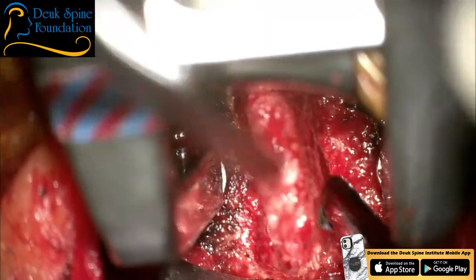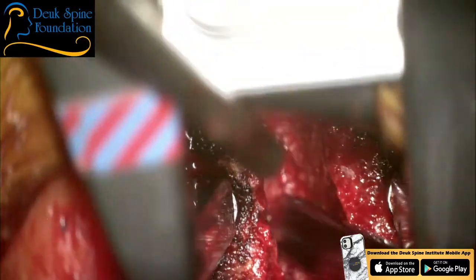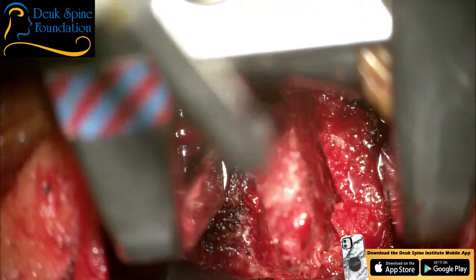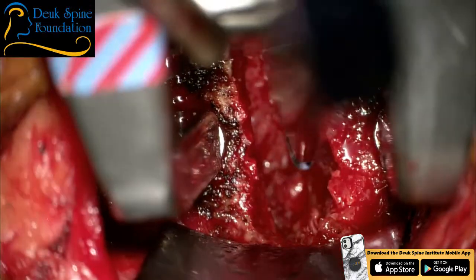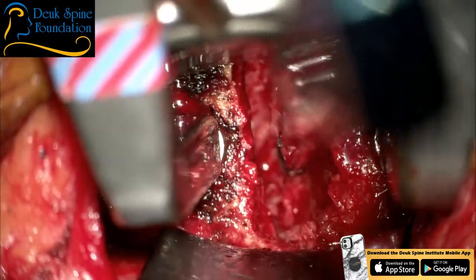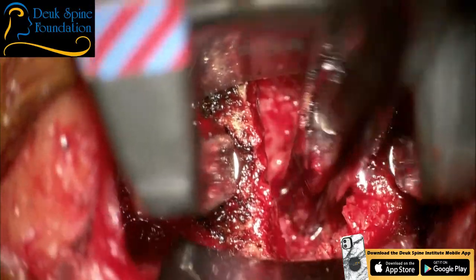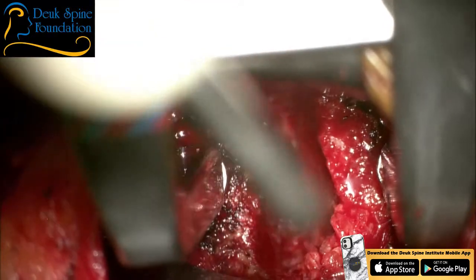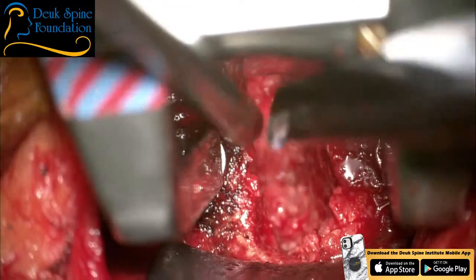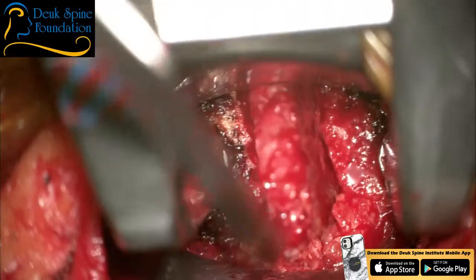Really much worse right here. You can see it. Big, big herniation here. I think he's going to do really, really well when we're done. Getting it all out, just little pieces, unfortunately. Sometimes we get the big guy coming out at one time, but most of the time it's called piecemeal. Piecemeal means you're getting little pieces out at a time. And that's what we're doing.